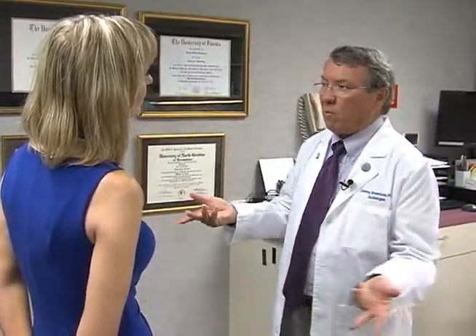Another innovation that I think has been very helpful is utilizing more than one microphone on a hearing aid. Initially there was one mic, it picked up everything in the room equally. But now we can use directional beams on hearing aids so that I can face you and you will be louder than the other noises in the room. And that's very helpful. Everyone is concerned with hearing aids whistling. I don't want to get a hearing aid because it's going to squeal. We now have feedback algorithms which can basically sense the feedback and immediately adjust the hearing aid to shut that down.